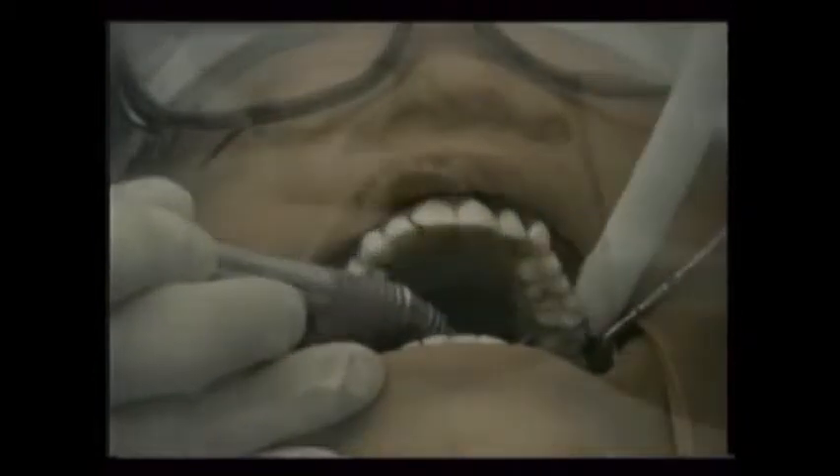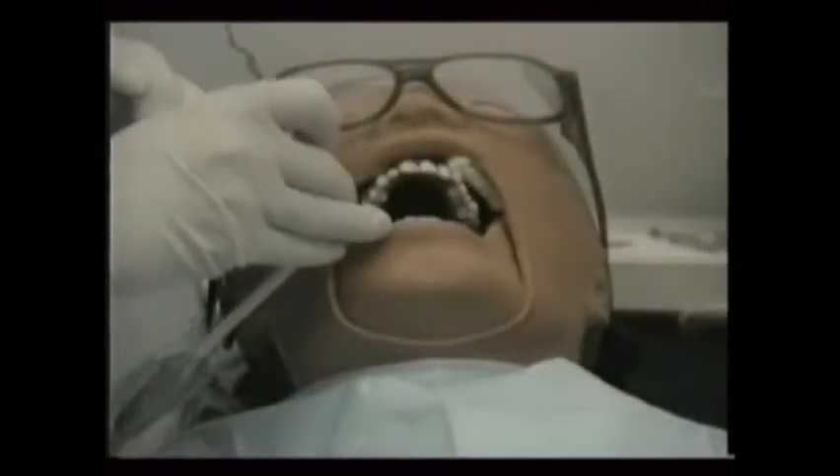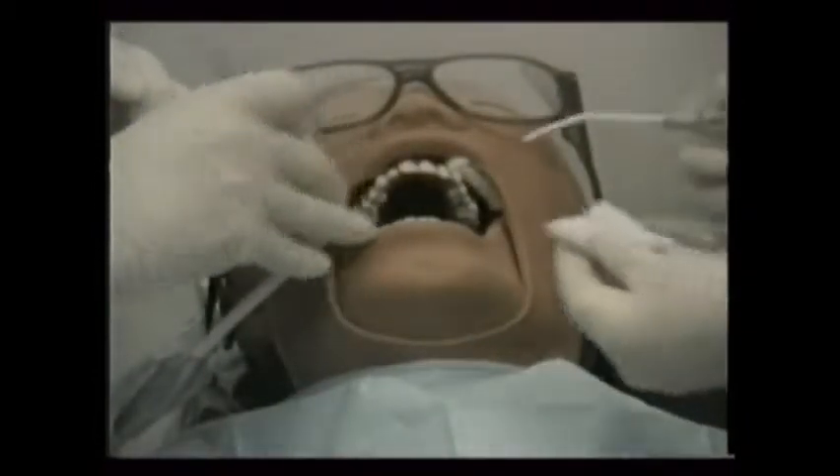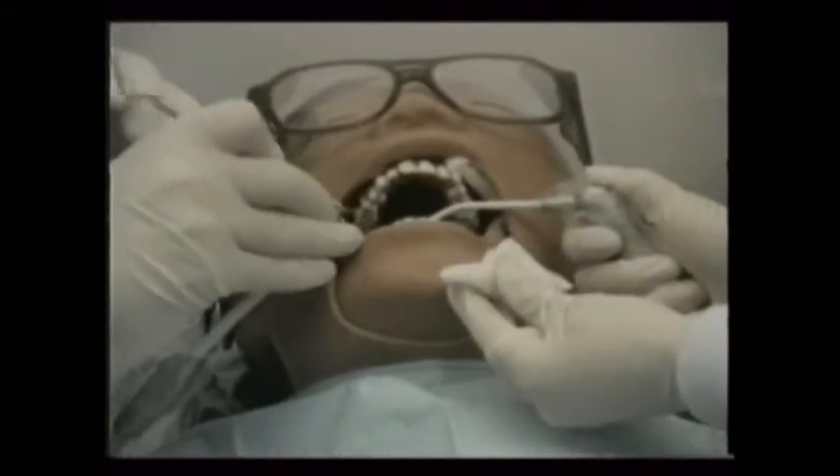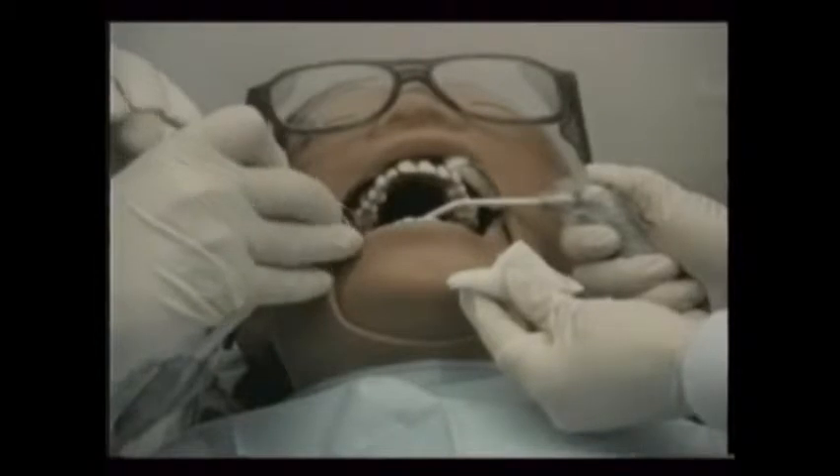Dental decay is soft, diseased dentin and enamel tooth structure. When a tooth is filled, the decay is first accessed and excavated, and then the remaining weak enamel is removed.